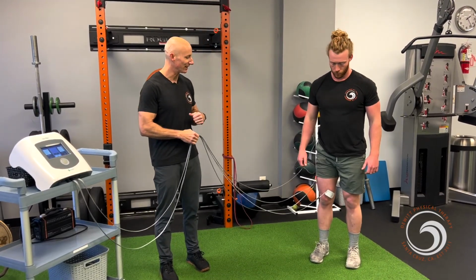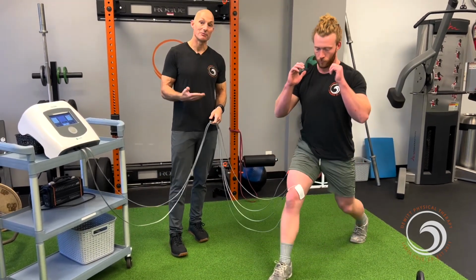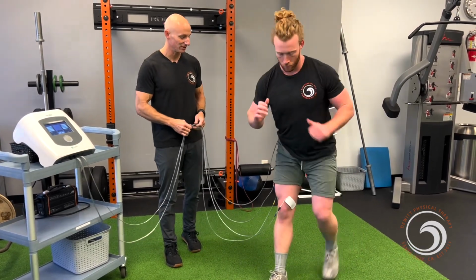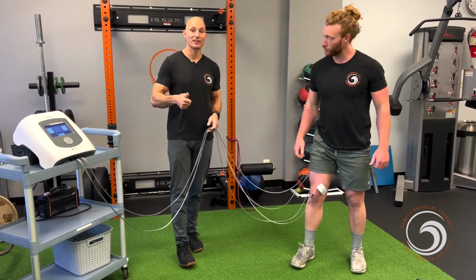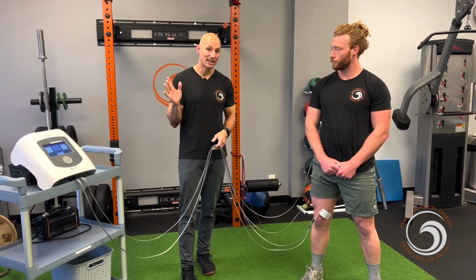Now, we can also do a split squat. We can work into his lunge position, and we can build it there too. Again, we're reinforcing movement patterns, reinforcing muscle activation, optimizing that. We can work on our hinges, so our deadlifts, picking things up off the ground. We can work on steps, really anything.